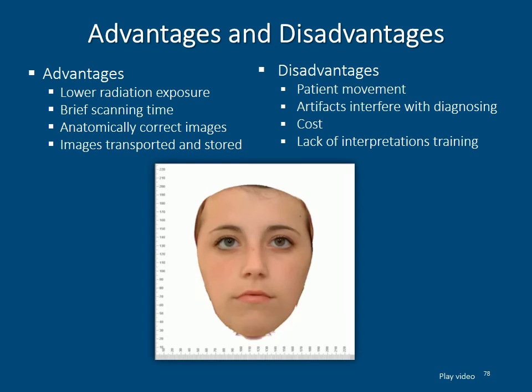The disadvantages are that because it is so high resolution and detail, patient movement can really interfere with the quality of the image. Artifacts also interfere with the diagnostic quality. It is extremely expensive, and it requires a lot of training to interpret the image, so there is a learning curve and a training curve that requires additional education for the operators who are viewing these films.